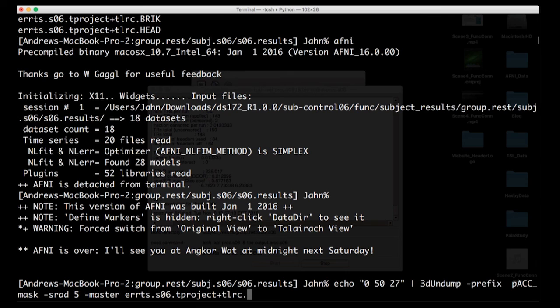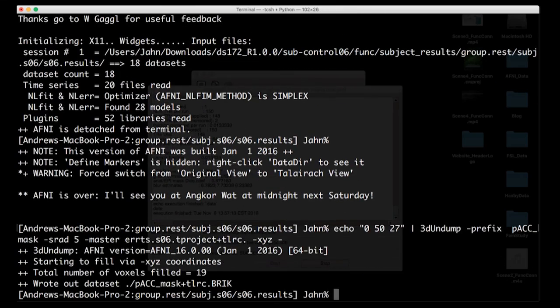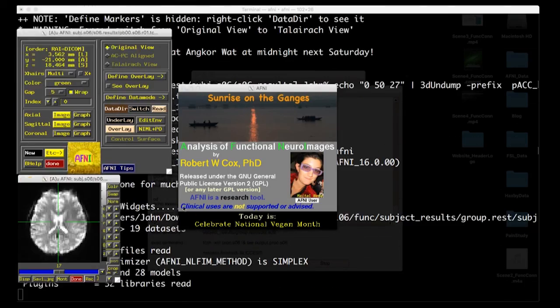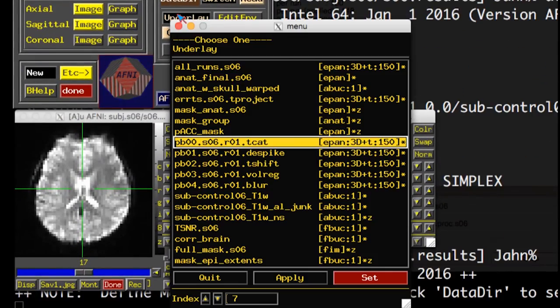Don't ask me why it's called that. And we're going to call this PCC_mask, and we're going to give it a radius as a sphere of five. And the master data set gives it the final dimensions of what we want the mask to be. So I'm going to give it the errtime_series because we're going to be extracting from that data set, right? And then lastly, XYZ, if I just put a dash, that means take these coordinates that I put before the pipe and put them into this argument right here. So I'm going to do that briefly check to make sure that indeed it is roughly where I want it to be.